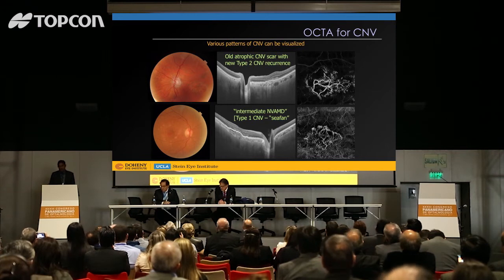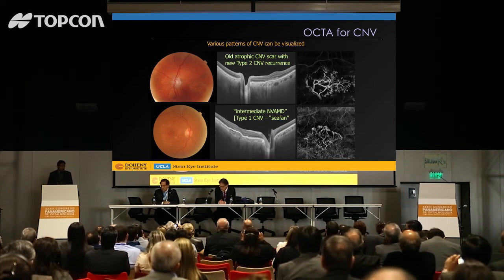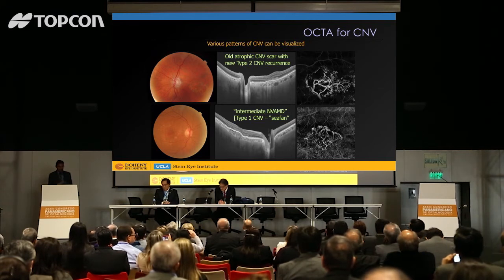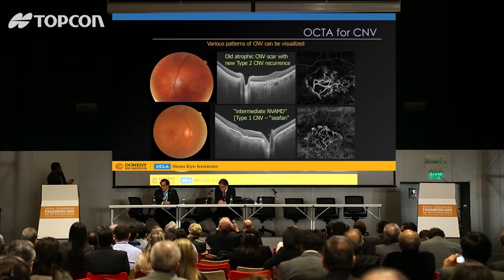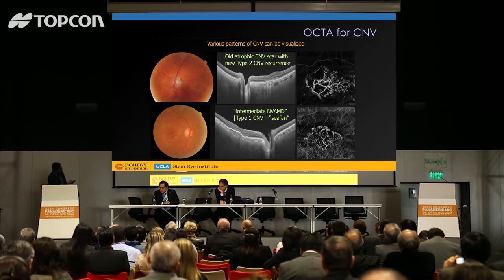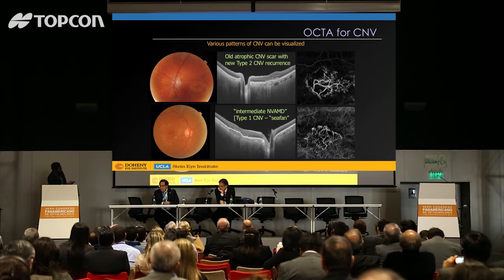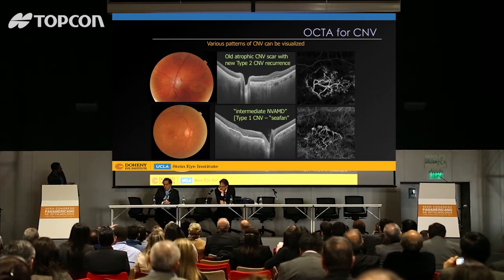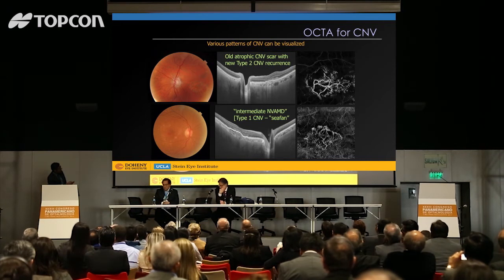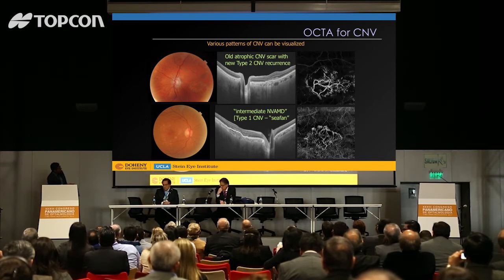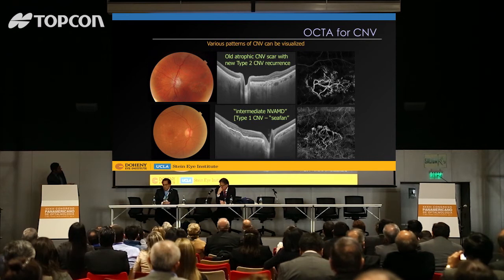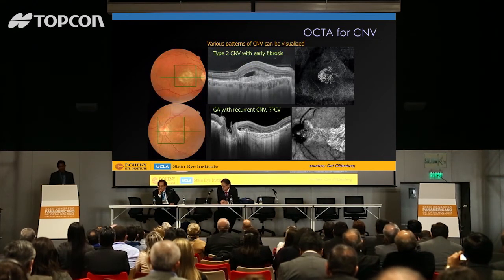We haven't really found a big difference between type 1 and type 2 lesions in terms of OCTA angiography. What really matters is how old the lesion is. This patient had a long-standing type 1 membrane — the neovascularization has fairly large vessels with large gaps between them. Then this patient developed a new area of type 2 recurrence in the subretinal space. What's more important than type 1 vs. type 2 is that this is a relatively newer lesion, and you can see the vascular density is quite different between the older and newer components.